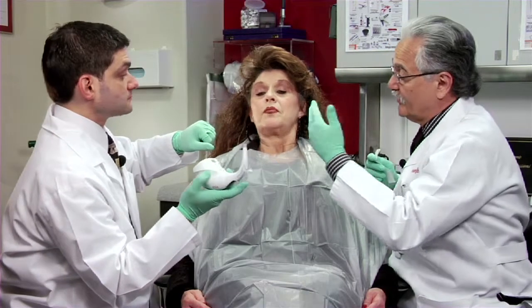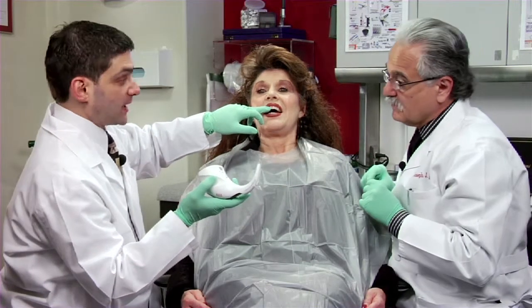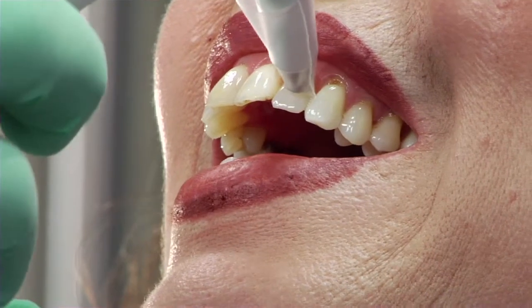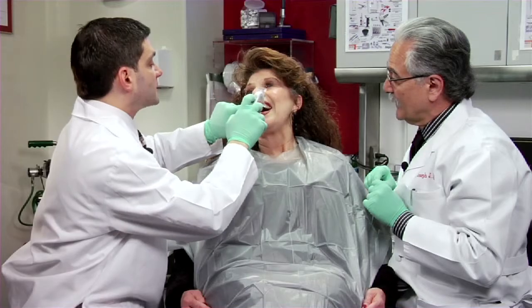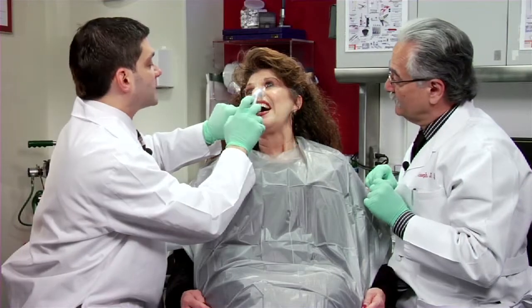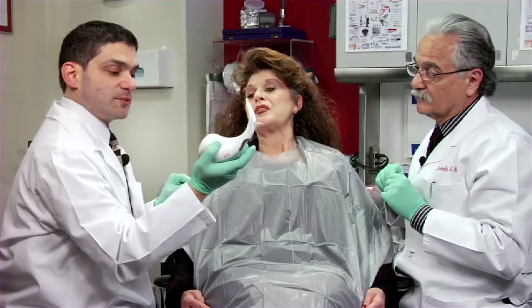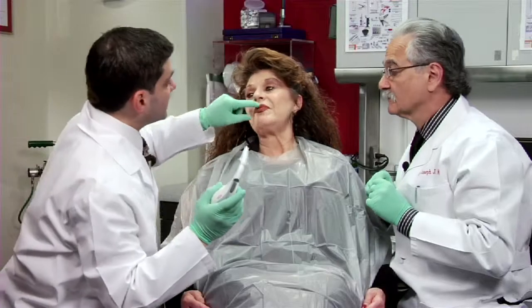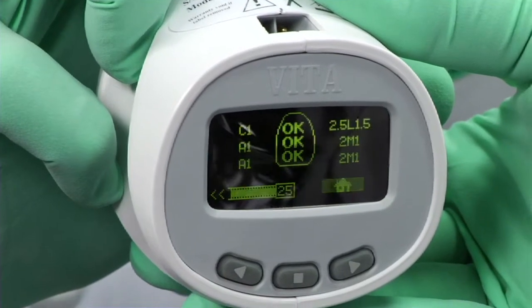That was tooth number eight, so those are the shades for number eight. Now we'll go ahead and take shades for tooth number ten — three shades on that tooth as well. We take the cervical, the middle, and the incisal. We got pretty even shading going from cervical to incisal — she's a little bit darker toward the cervical, which you would expect. That gives your laboratory technician the three areas of shading on the adjacent teeth.